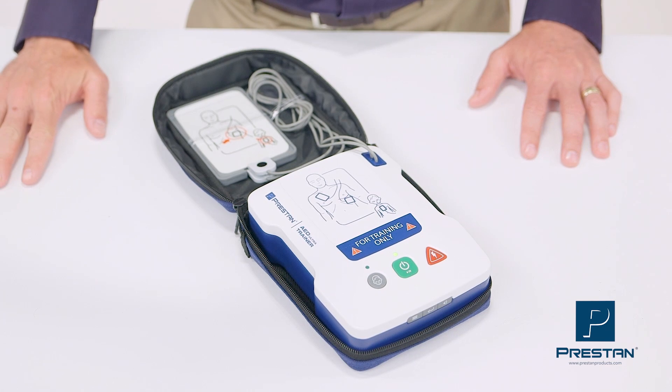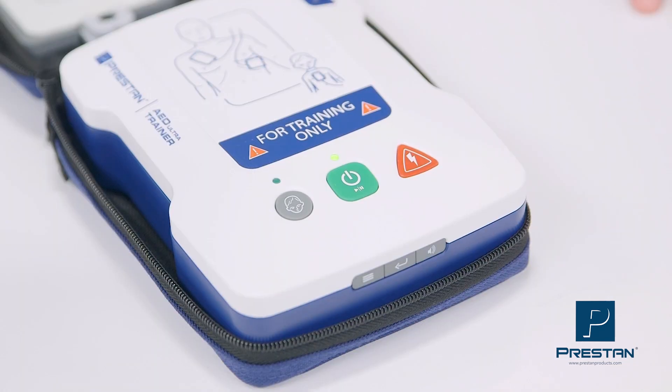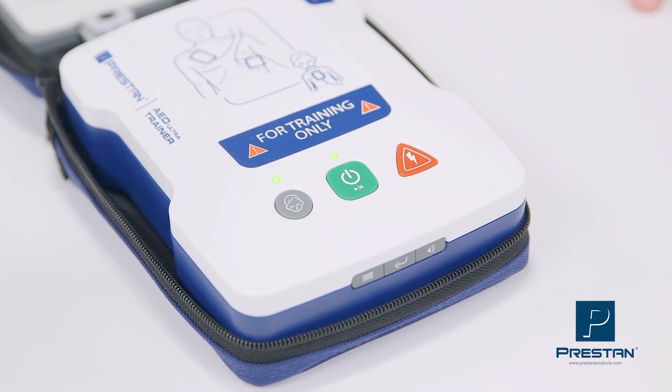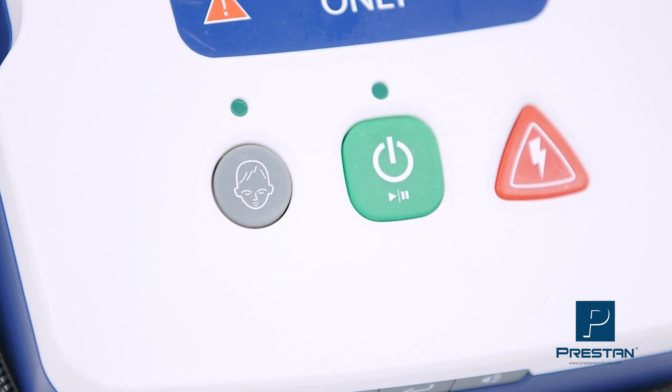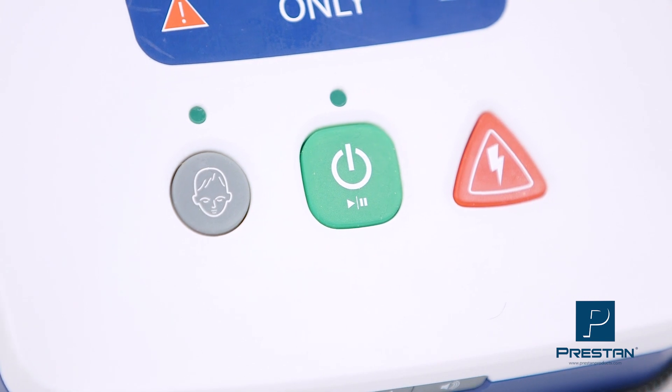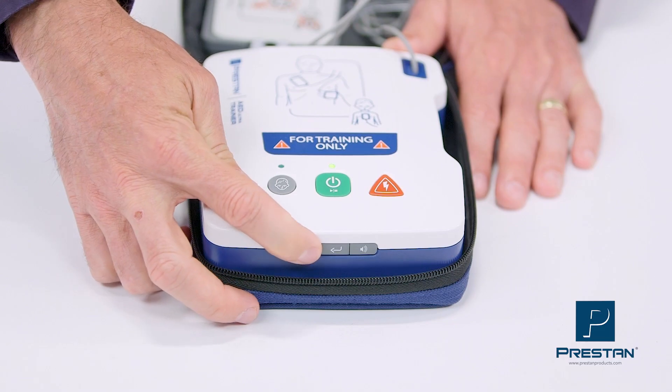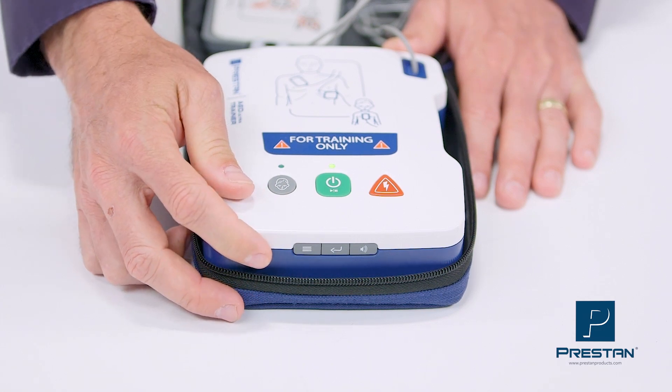The Preston AED Ultra Trainer is the first and only universal trainer to have a child button. If the patient is a child, press the child button, which best simulates modern live AEDs, giving your students a realistic training experience.